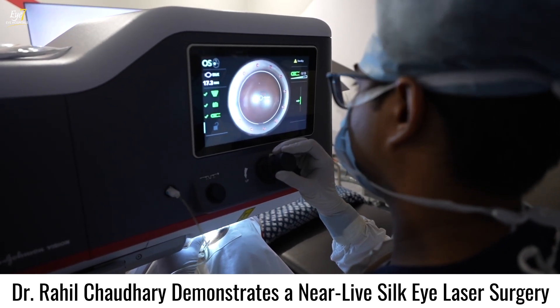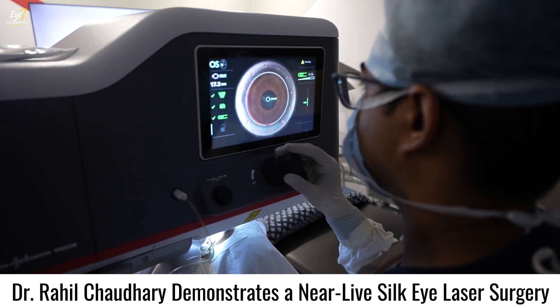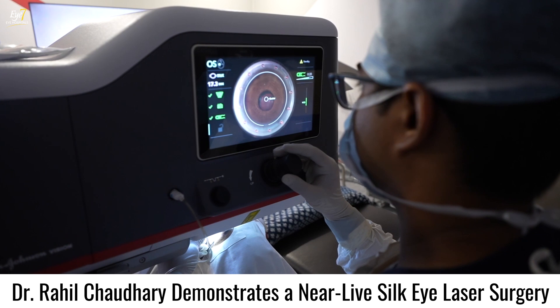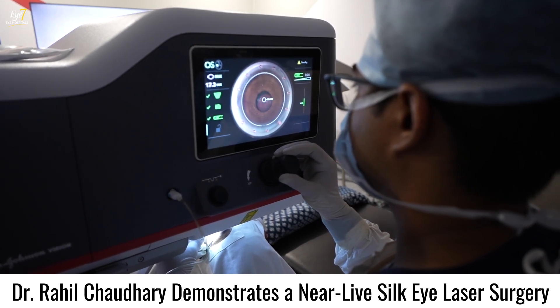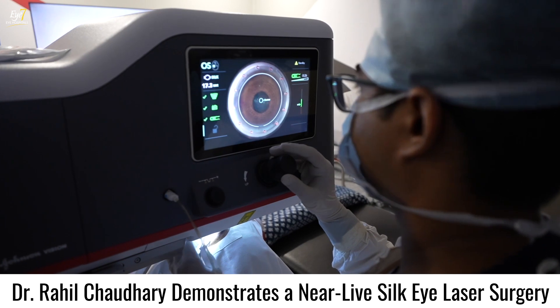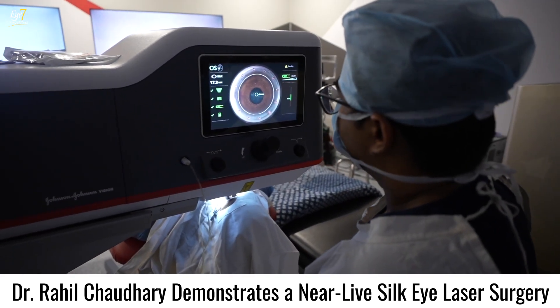To date I have not had even a single case of suction loss. The machine docks like a breeze — it is nice and easy with a very low learning curve. Once the machine is docked, we start setting the parameters on the screen.